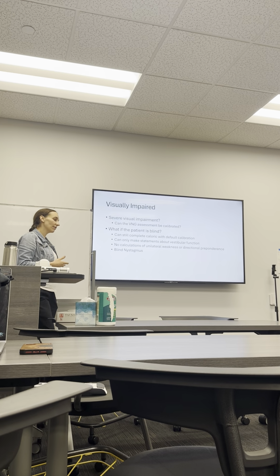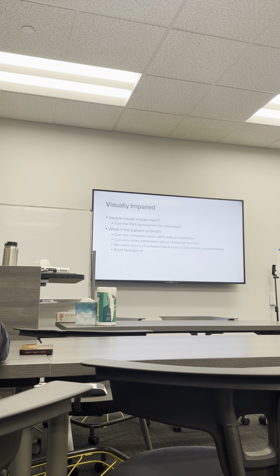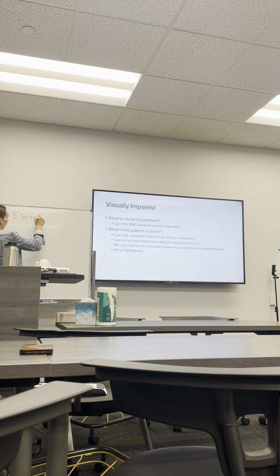There's another assessment and evaluation called an ENG, electronystagmography. That's a word. Use that in Scrabble, okay? Electronystagmography uses electrodes.